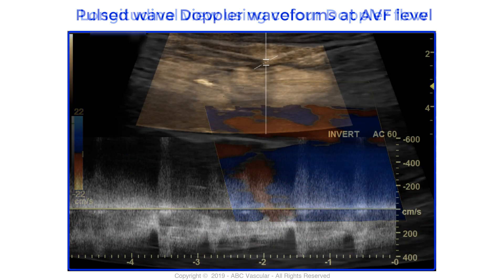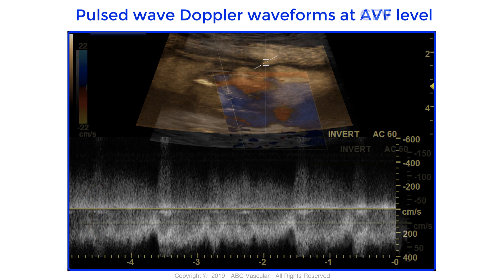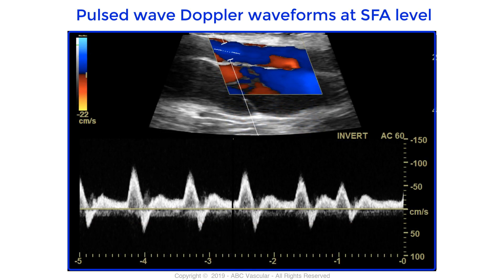To confirm the presence of the arteriovenous fistula, pulsed wave Doppler is recorded at the level of the arteriovenous fistula site, demonstrating high blood flow velocity by direction of flow. The flow is sampled at the level of the common femoral vein, which appears arterialized and non-phasic, as typical of veins affected by a fistula. The flow within the artery is of lower resistance, as demonstrated by a more prominent diastolic phase due to the presence of the arteriovenous fistula.